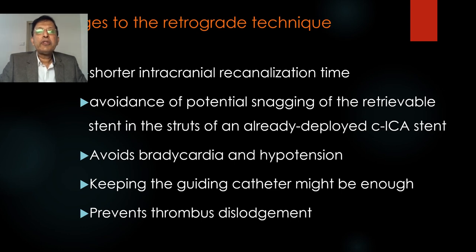At the time of stenting, there was a significant bradycardia and the patient almost went into asystole and arrest. The patient had to be intubated, shock had to be given. It did not revert with atropine. So almost lost around 15 minutes in that process, and that delayed the intracranial recanalization.